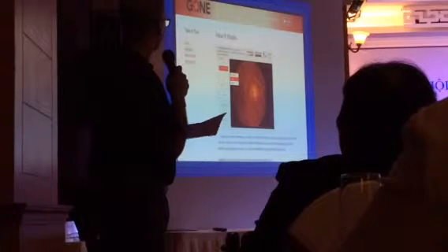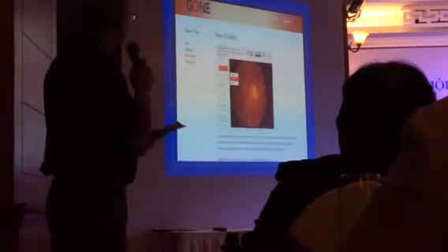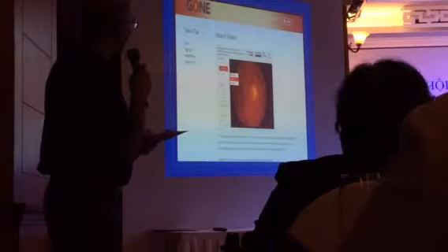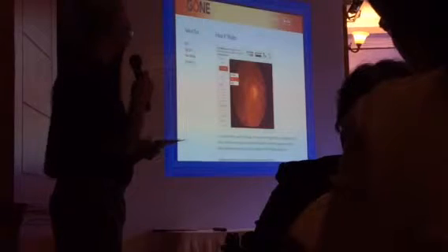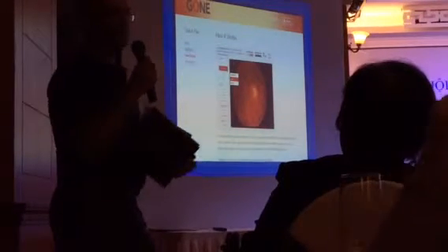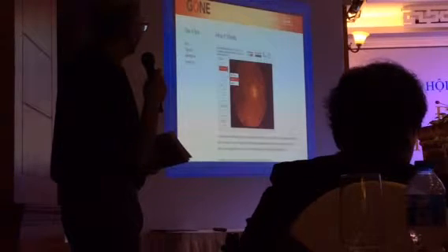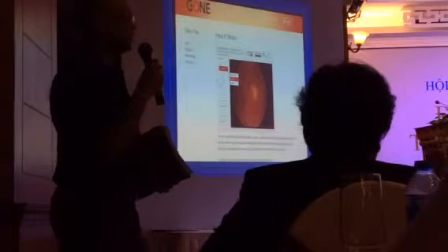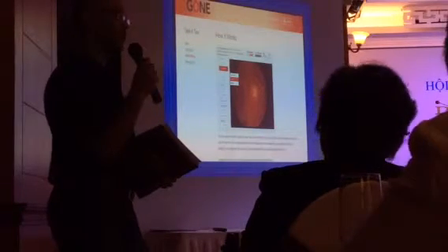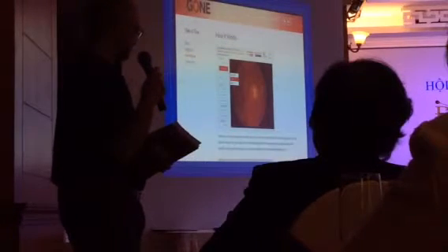Okay. So on the left, you have your drop-down menu, and you have a clock in the top there. It also tells you how many discs you've looked at, how many left to go, and as I said, you can pause it and come back to that. And that's about the image that you get. Sometimes you do get a much more close-up image of the disc, but that's roughly the magnification that you'll get.